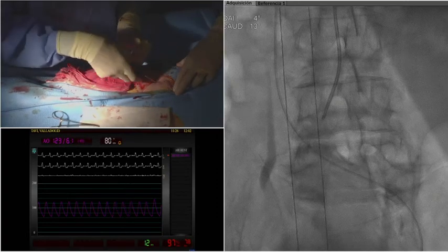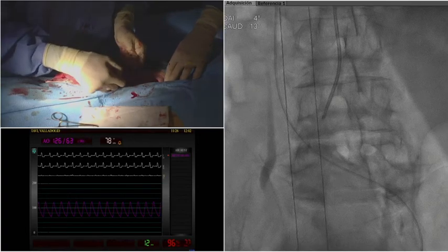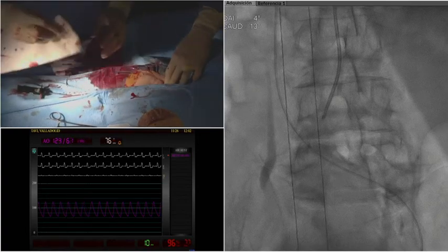Okay, then we're going to check. It seems okay. We always do a few minutes of compression, but we can do a quick check by angio.